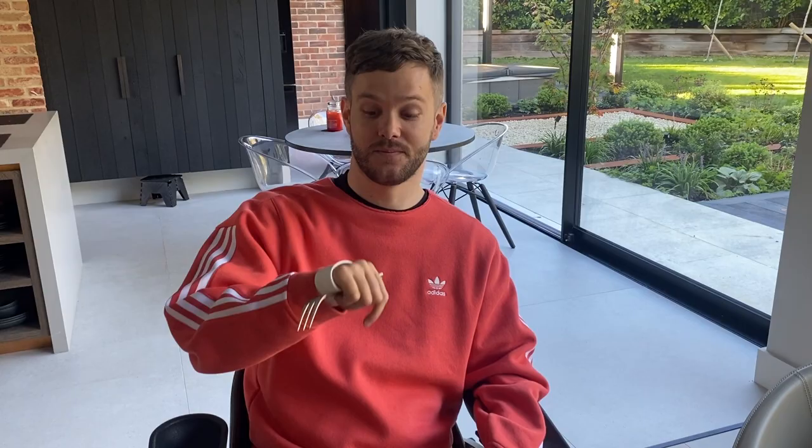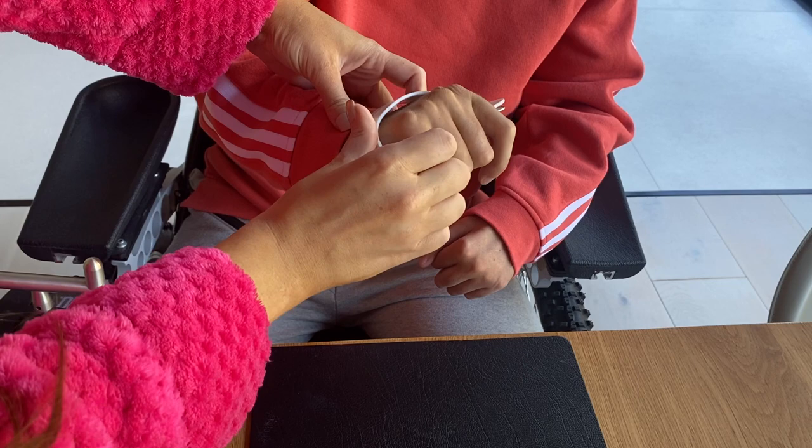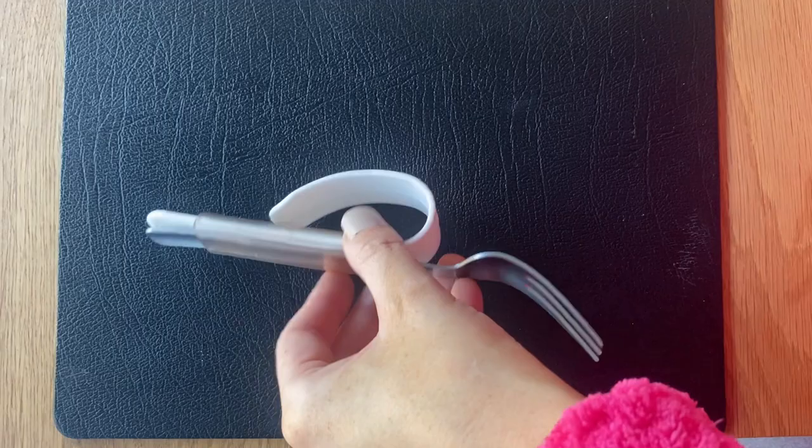So let's start with how I eat. We go out for food fairly often and I always get questions about how my fork works. Basically it just slips straight onto my hand. It's interchangeable — there's a plastic covering that you can slide a fork into or a spoon, which is quite handy if you go out to a restaurant and you've forgotten your particular fork.